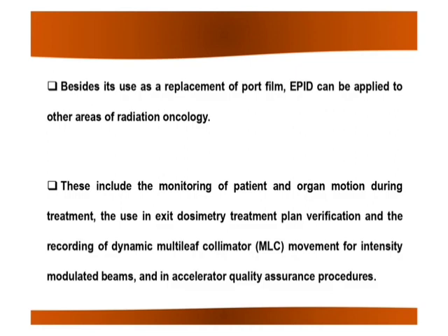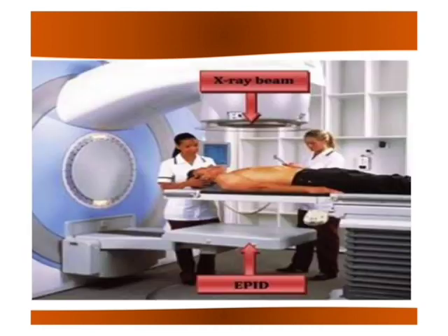If a patient is imaged on different makes of machine, by which different modalities of patient scanning are done in non-identical positions, there is a high chance of false assessment. So this can be minimized by using the CT, MRI, PET fusion image. Therefore, it is necessary for diagnostic radiologists to have a basic knowledge of radiotherapy and the importance of radiotherapy position.